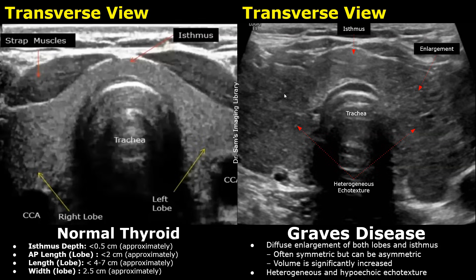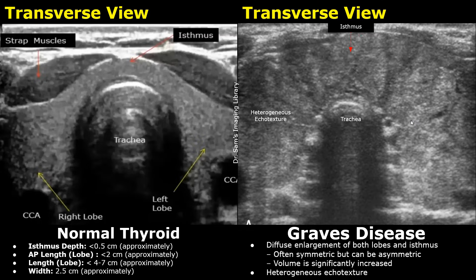The enlargement is usually symmetric, but it can be asymmetric in some cases. Here is another case showing an enlarged thyroid gland with a heterogeneous echo texture. This enlargement is more severe than the previous case. This thyroid is heterogeneous, but not really hypoechoic, so this type of appearance can also occur. The isthmus is very thick, and so are the right and left lobes.